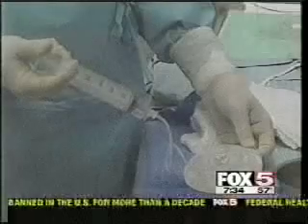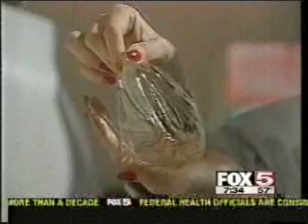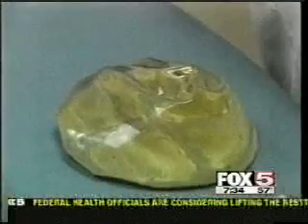Yeah, it's an emotionally charged issue. You hit the nail completely on the head, and it always has been. Do I do silicone implants? Yes, but according to the FDA, I can only put them in certain individuals for certain criteria. You have to fill out forms. Typically, in my practice, we use them for reconstructive surgery.